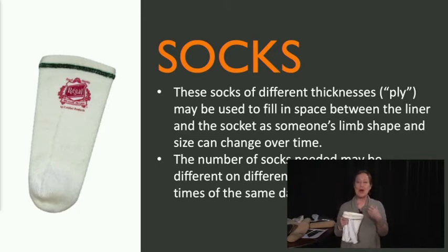However, think about all of the information that is given to a patient on the day of delivery. It's a lot of information. So even if they get a handout about sock management, I don't think they really internalize what it means until they have to do it.